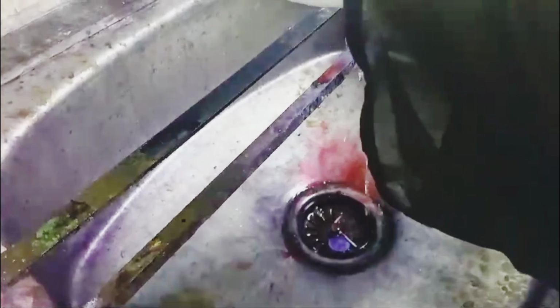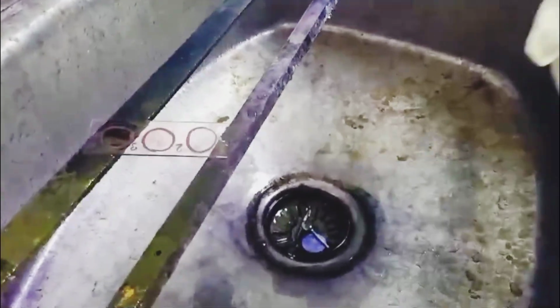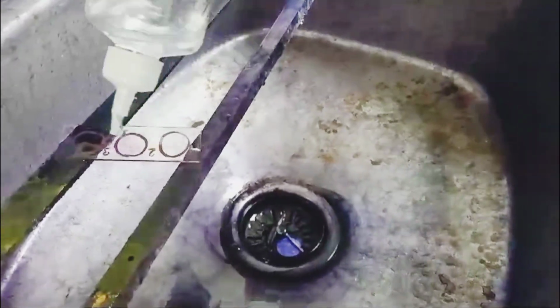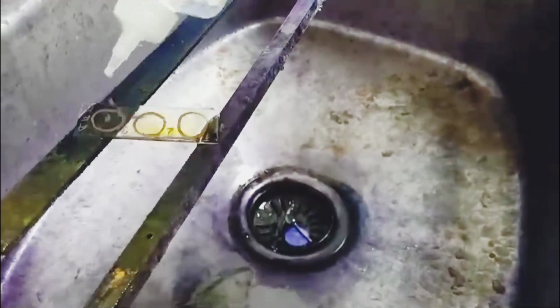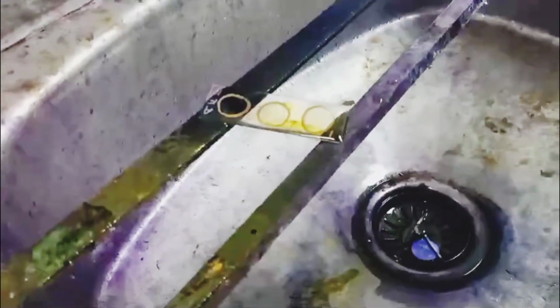After the primary stain, wash the slide. Clean the background. H2SO4 at 20% is the decolorizer. Pour this on the slide. Wait for 1 minute.